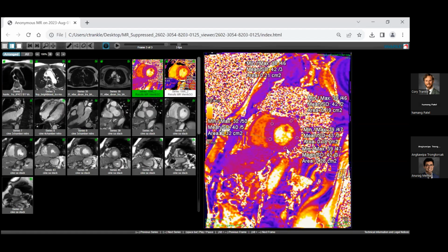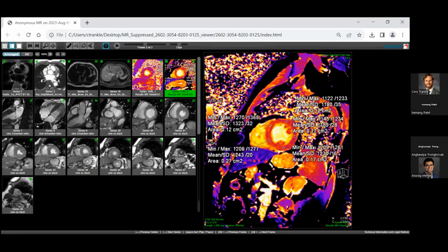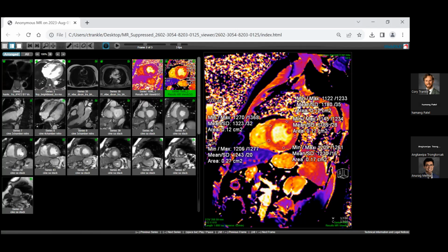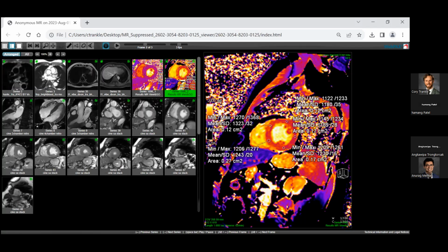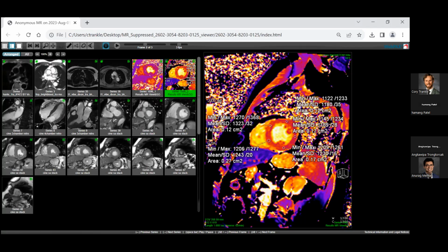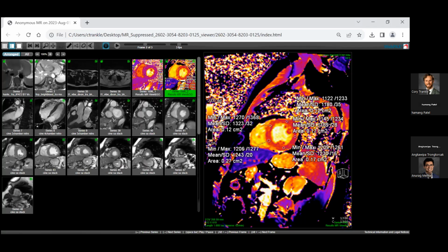So remember, the T2 is that quick transition. Remember, we go back to our diagram of our protons, and we had that quick angle change. That's only 50 milliseconds. That's a quick period of time. But then we have the winding and the unwinding. That takes longer. So now we are up near 1,000 milliseconds. And at a 3 Tesla, we remembered that it's not 1,000, the number, it's 1,300 milliseconds, right? So here is a T1 map.